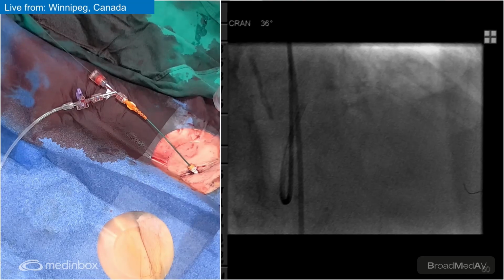Yeah, there are multiple ways of measuring that. Obviously, you can look at the markers up top. We can do a more accurate measurement this way. As I move down here to the ostium, you're taking 22. I would spare the ostium if you can. Let's go to the proximal lesion. You're looking at 15, 16. I was thinking about a 3.5/16 stent.